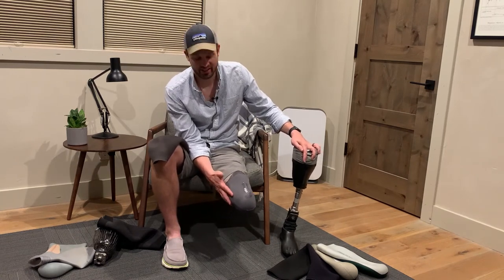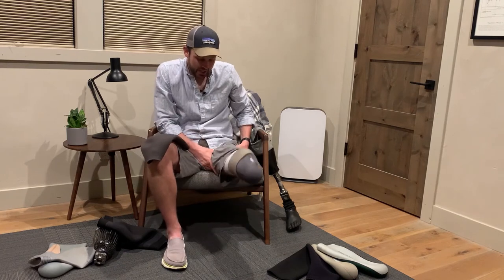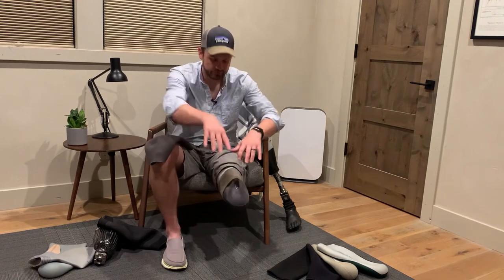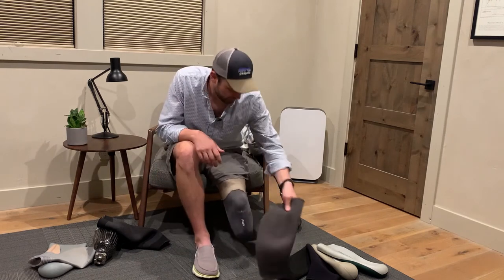The shorter your liner is, the less surface area you have on your body. If you're sweating and only a small amount is in contact, it's not going to take much for it to slip off — whereas if it goes all the way up your leg, a lot more sweat and slippage has to happen for it to come off. He keeps two sets: one short set to wear around the house when he knows he's not going to be sweating, and the really long ones for a long run or something really active — it's hotter but gives you a better fit.